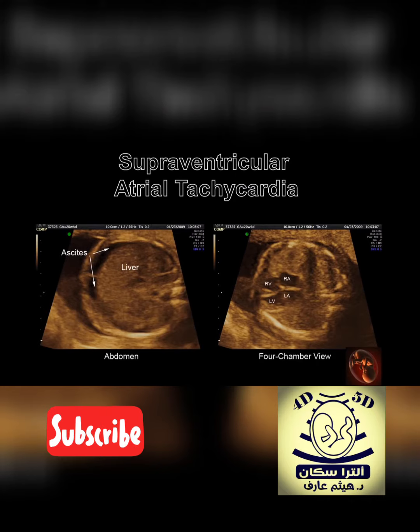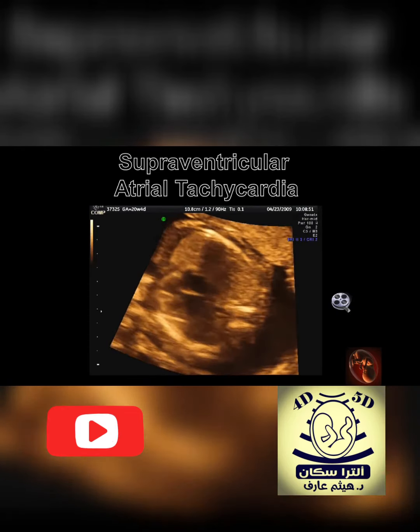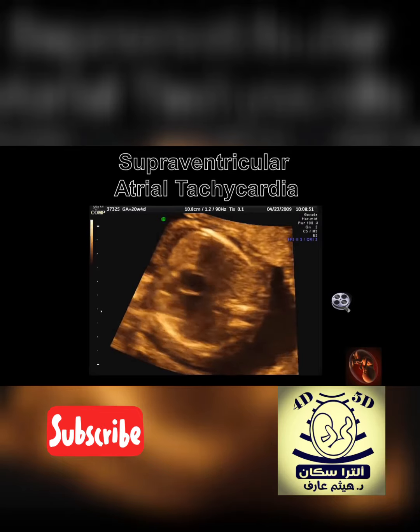This is an example of a 20-week fetus with a supraventricular atrial tachycardia of 245 beats per minute. Notice the ascites. This is a cine clip from the fetus with supraventricular atrial tachycardia. The four-chamber view also demonstrates a ventricular septal defect.